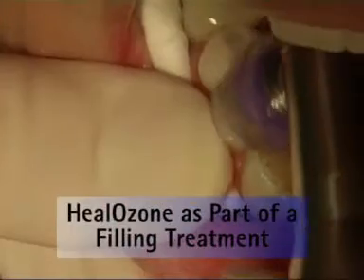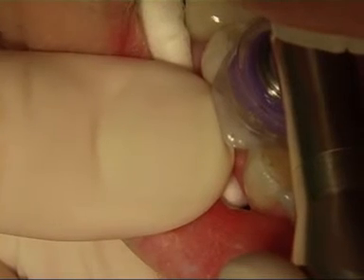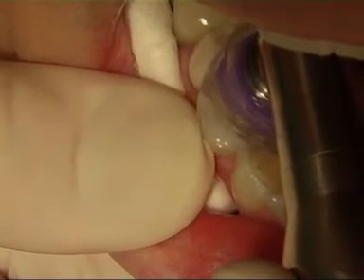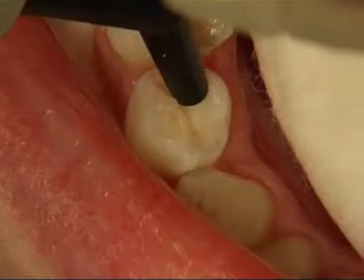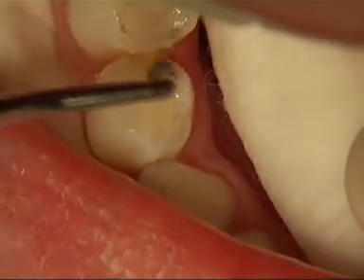Experience has shown that Kavo Helosone also plays a decisive role in filling procedures. Applying ozone guarantees a sterile, germ-free fissure, thus preventing caries from reforming beneath a new filling.